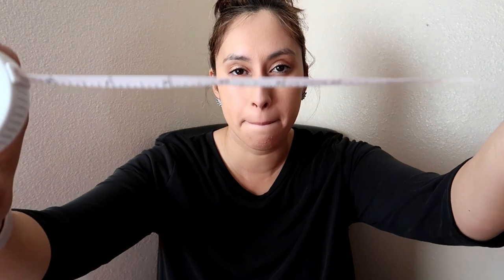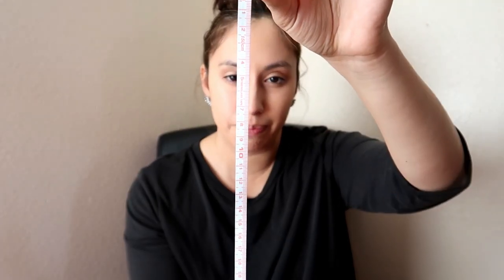The other thing we use for physical assessment is measuring tape. Measuring tape is very important. We usually use it in our health assessment videos to measure the liver. You could also measure the spleen, but usually it's not palpable and it's very deep, so that would be kind of hard.